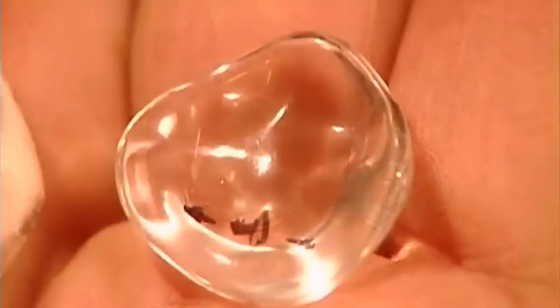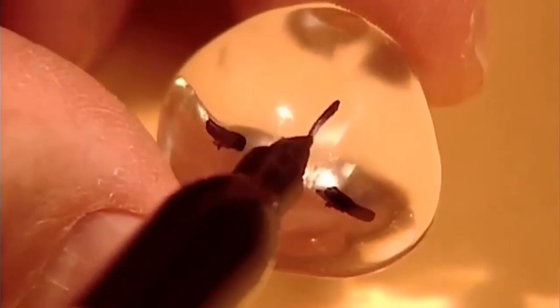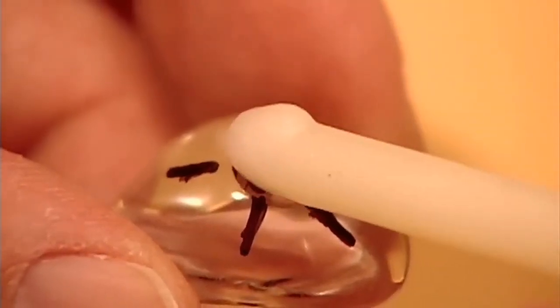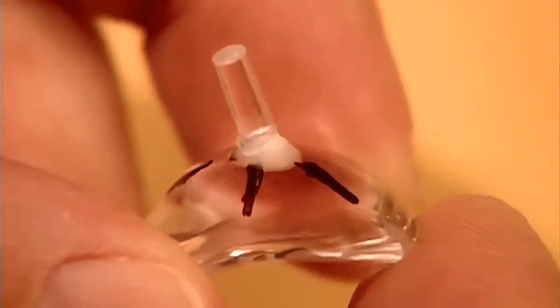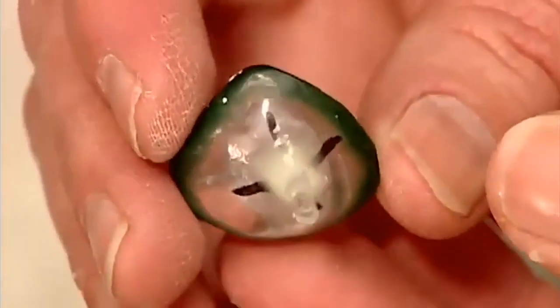Here's the original impression compared to the acrylic model they've just cast. This model is called the fitting shape because they use it to fit and mark the positioning of the fake iris. They accentuate the markings, then attach a peg with a drop of wax. The peg indicates the natural angle of the iris when the patient is looking forward. Next, they add wax around the perimeter to enlarge the fitting shape. This excess will give the ocularist some play afterwards for the final sizing.